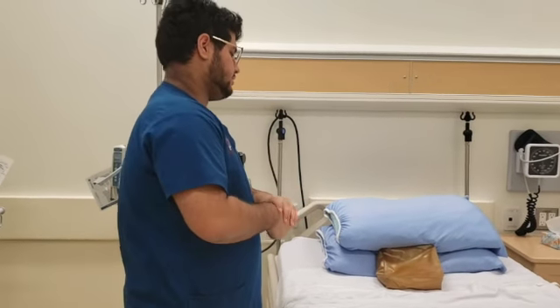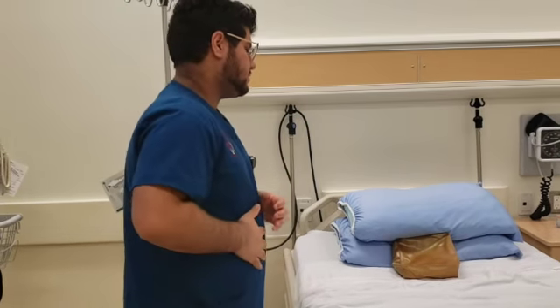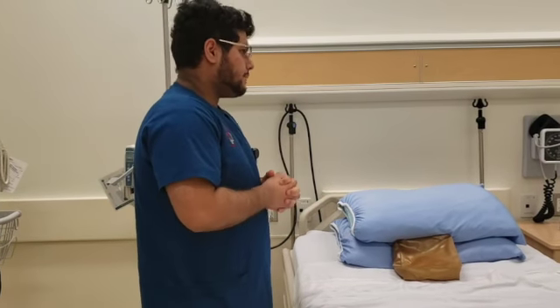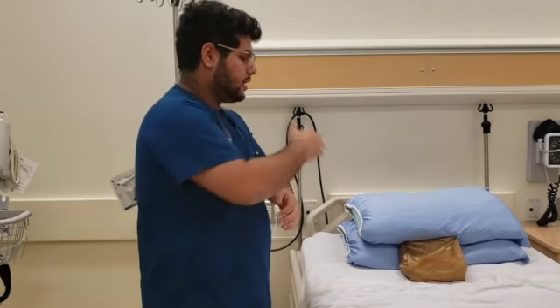And the other one is subcutaneous, which we'll be giving at the abdominal area. There are multiple sites that we can give it at, but just abdominal is the most accessible one. It's the easiest one in this case. So I'll be giving the heparin, which is subcutaneous at your abdomen, and I'll be giving the Haldol at your deltoid muscle. And now I'll just put my gloves on.